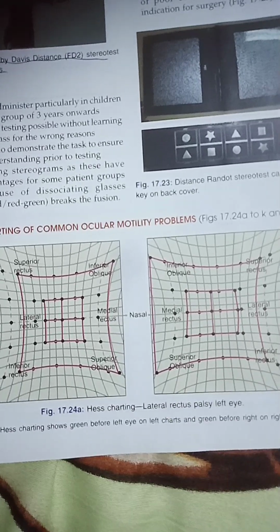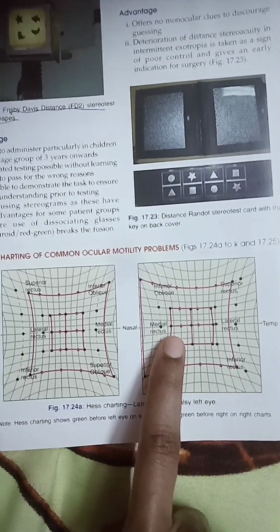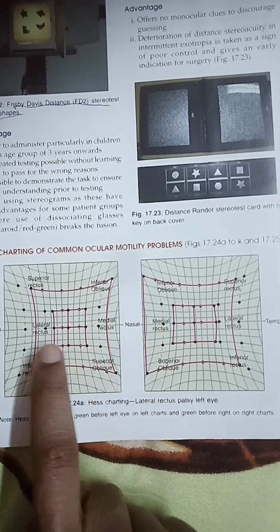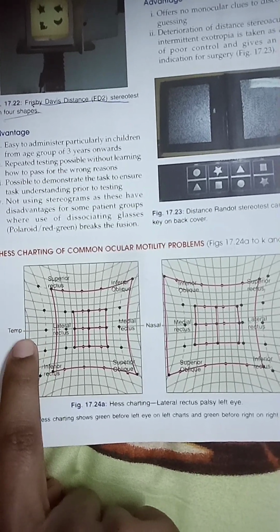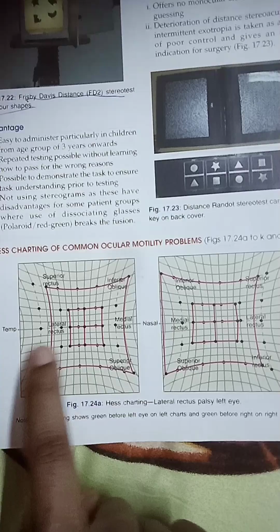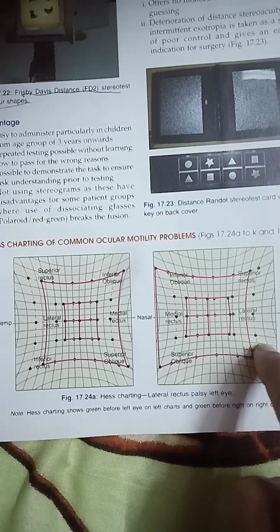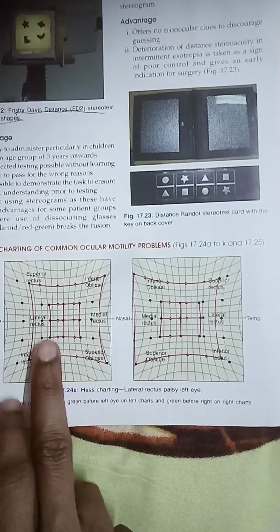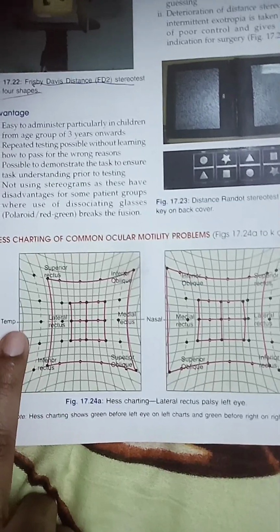As this medial rectus is overacting, its contralateral synergist, the lateral rectus, is underacting. So this is the muscle that is affected. This left eye lateral rectus is affected because its contralateral synergist is overacting here. This abduction is also limited here. It's almost a spreading of the comitance, between acute and late onset. It's a paralytic squint, left lateral rectus palsy.